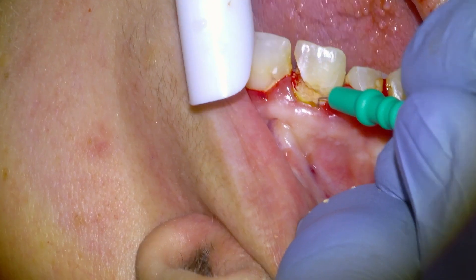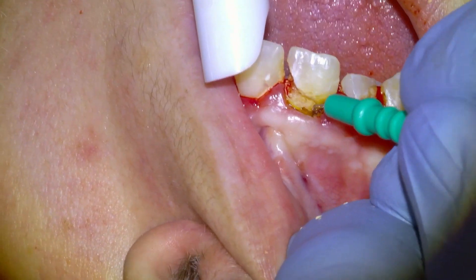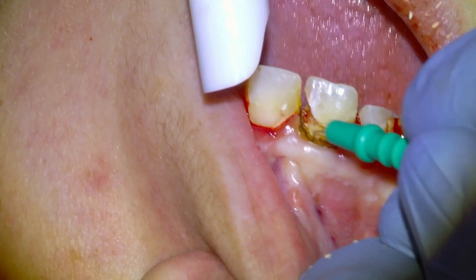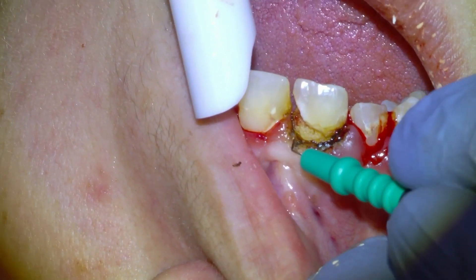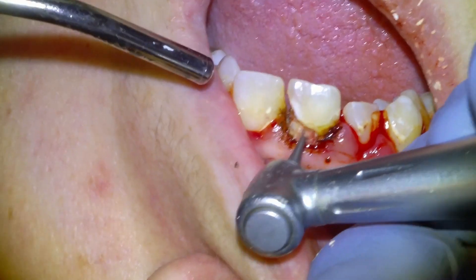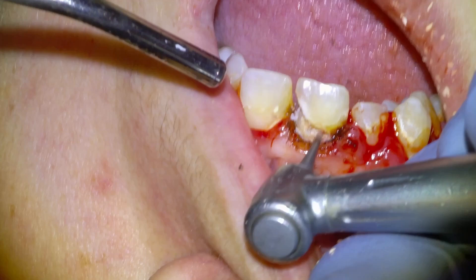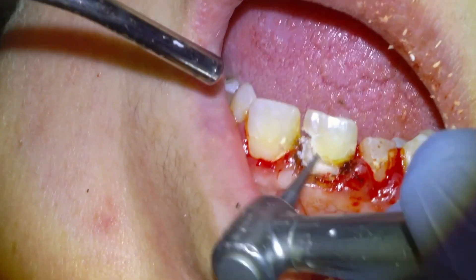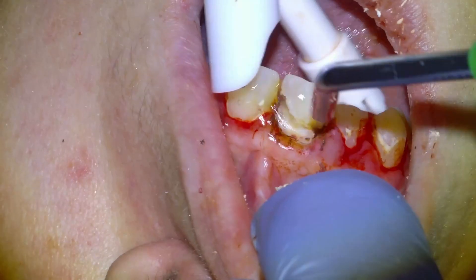Since the tooth decay goes a little bit below the gums, I'm going to use this electrocautery tip to basically ablate some of the gum tissue so that we have a good millimeter or two of clean, hard tooth tissue. Once we have accessed the margin of the clean tooth, we're going to start to remove the tooth decay using this slow speed handpiece. Tooth decay is quite soft and it just peels away.